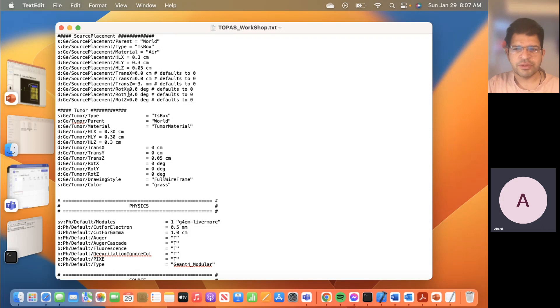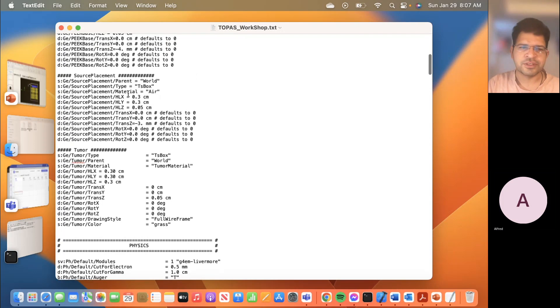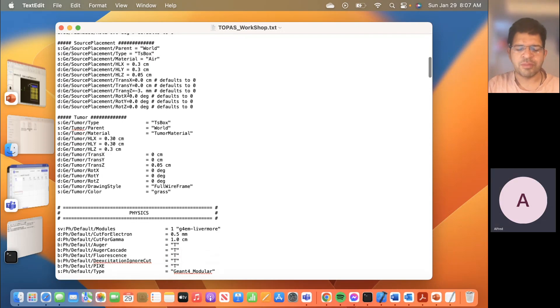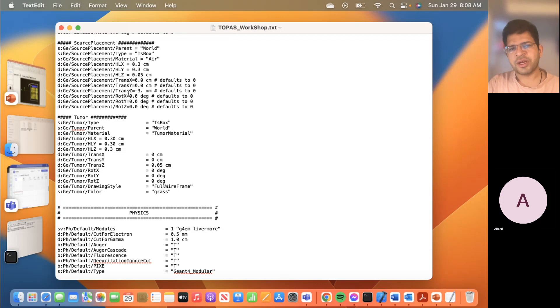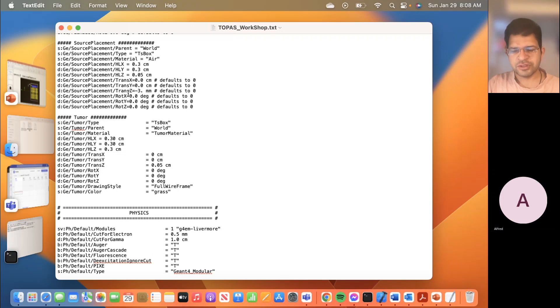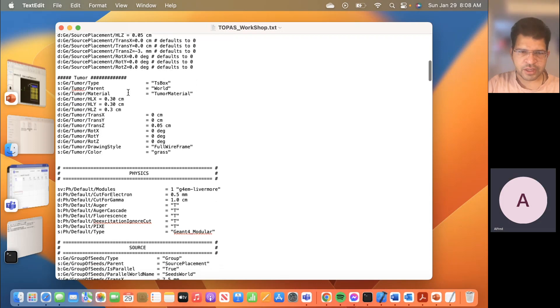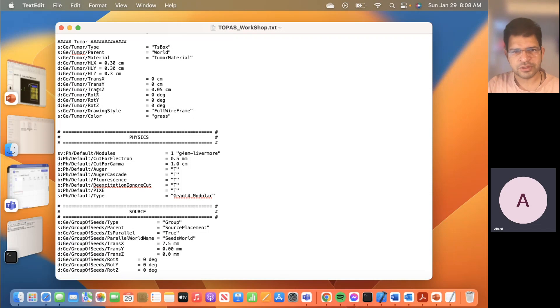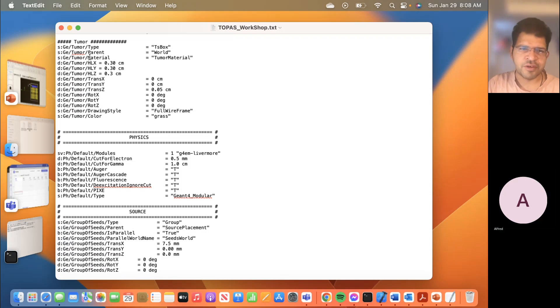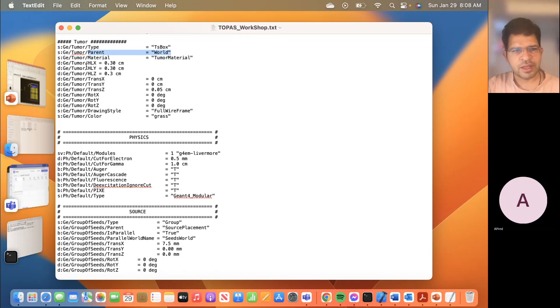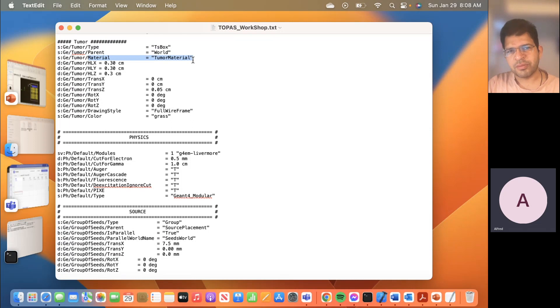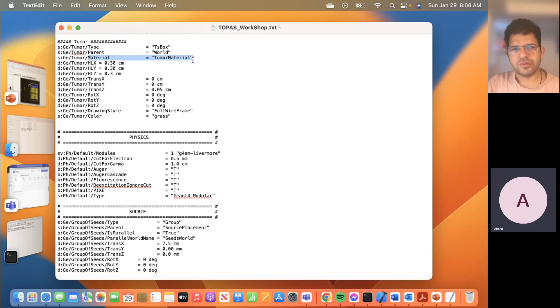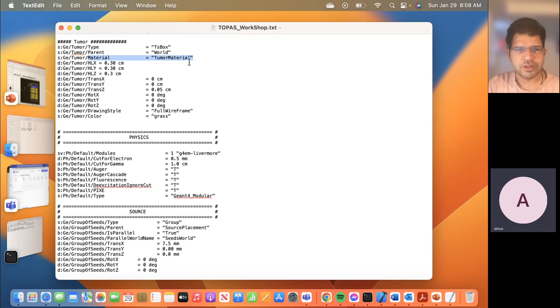Generally if you will be doing a brachytherapy simulation you will need something like this. Here I just created a box and inside that box I placed the seed. But maybe in your case you will be defining some kind of implant in which you will be placing the seeds. That's why I created this box so that you get an idea of the parallel geometry. Then there is this box I called a tumor box. If you define a box you define its type, what is its parent, and then what is its material.